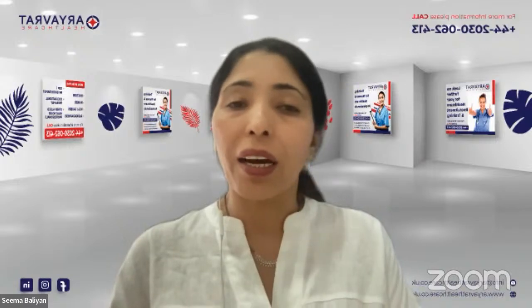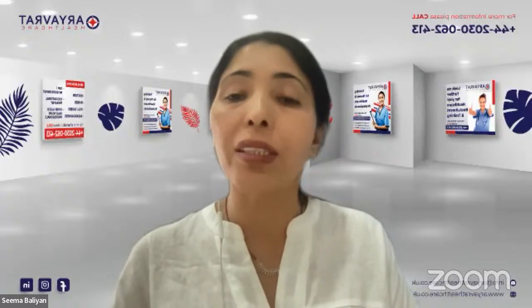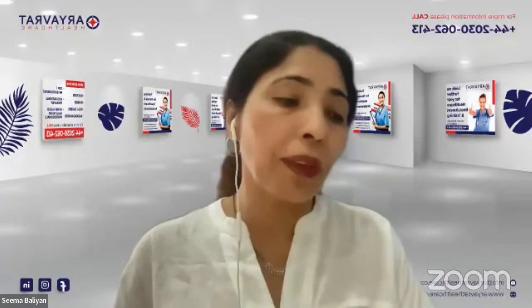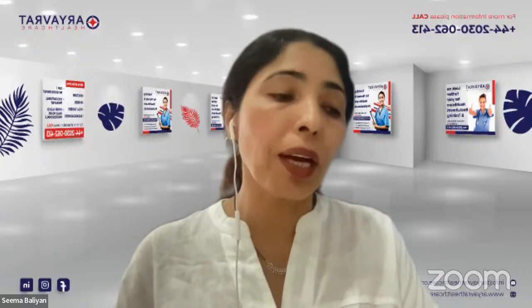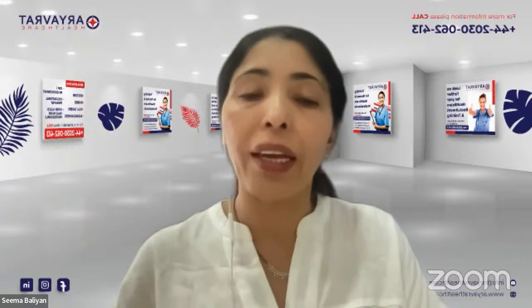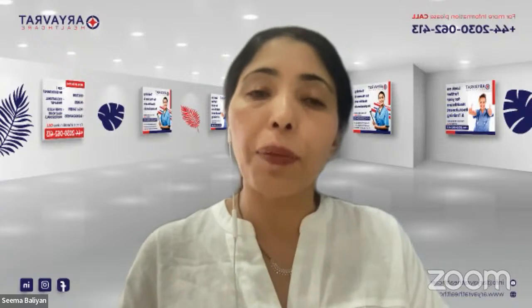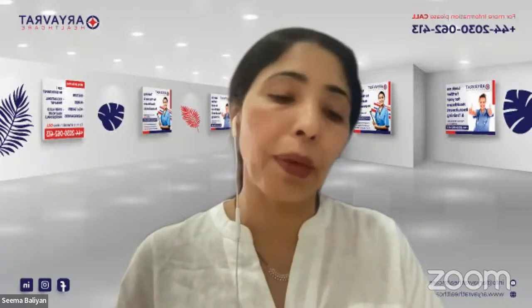They are trying, but they are not able to get maximum utilization of it. So sometimes, to make it easy for the patient, you give another device called a spacer. Imagine a small child or a very elderly person, who will find difficulty in coordinating the breath as well as using the inhaler at the same time. So you use a spacer in which the medicine is held while the patient is taking the medicine, and it becomes a slightly better way of giving the medicine to them.